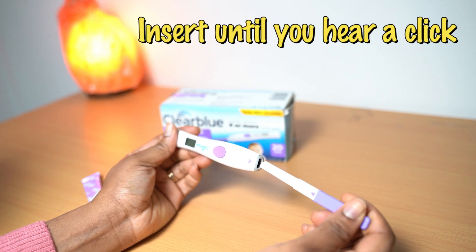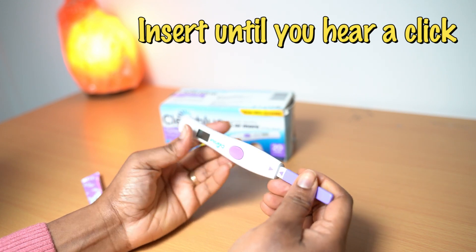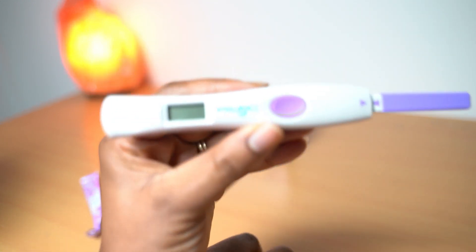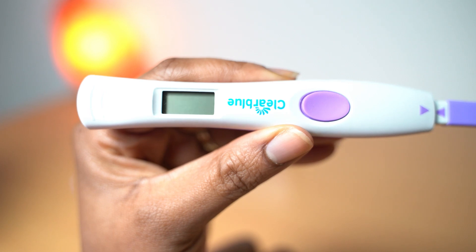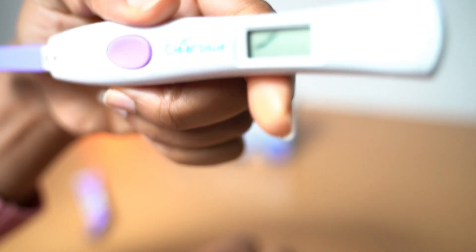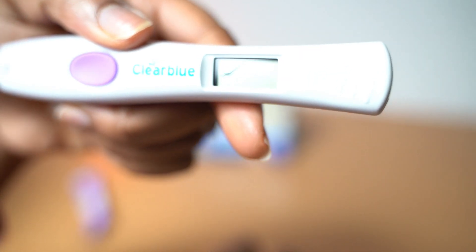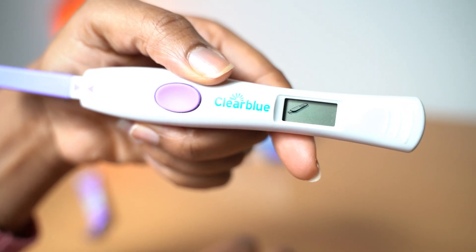So if I pull this inside like that — if you look, it's blinking. See, it's blinking. If I turn it like that, it blinks and look what it's showing — it's ready to be used.